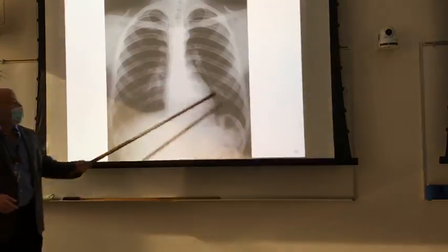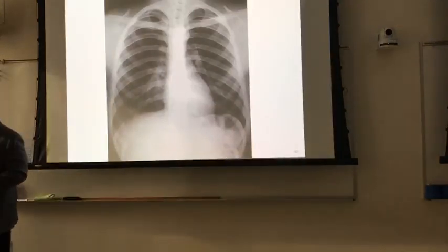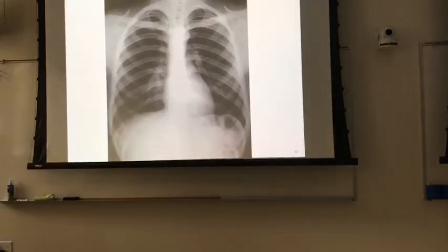We want to make sure we've got both sides of the lung. We want to see from top to the bottom, and that's pretty much our PA chest X-ray. We also don't want to see any motion. And how you're going to hopefully eliminate motion is by having the patient do what? Take a deep breath in, hold it, and let it out. Now blow it out, take another deep breath in and hold it, right? Don't forget to tell your patient to breathe afterwards.